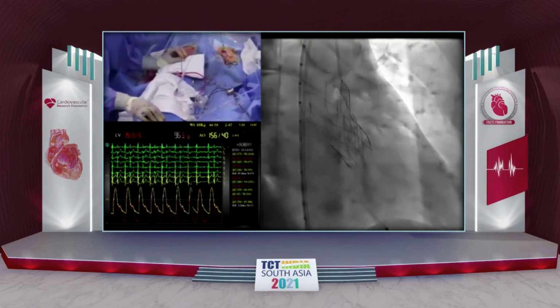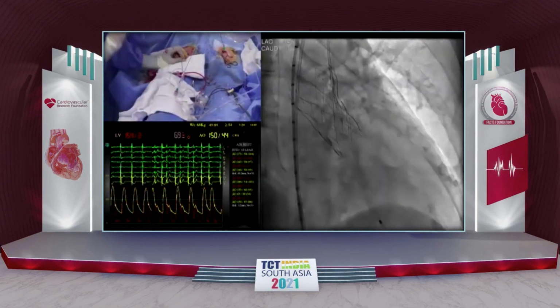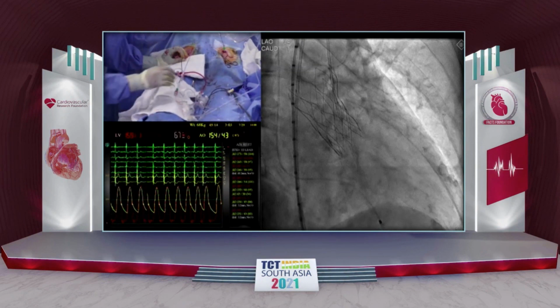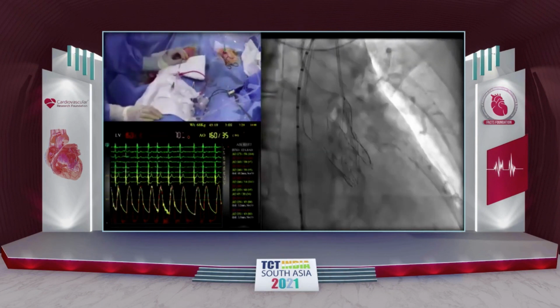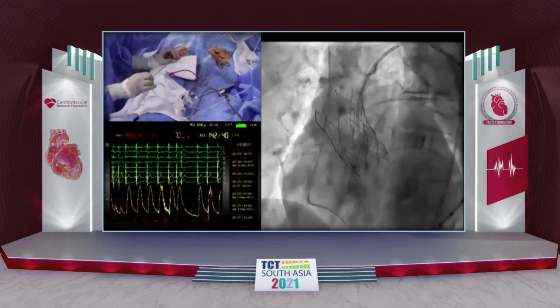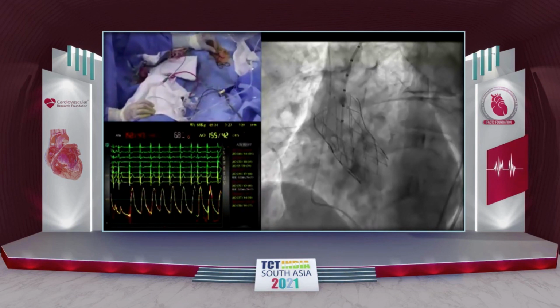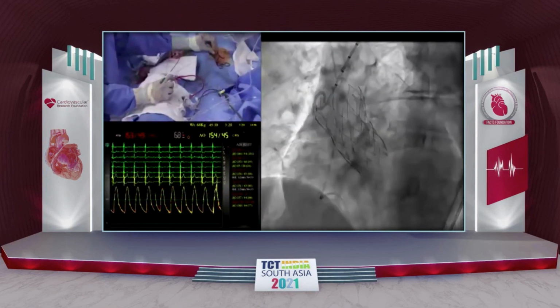And so see, you're right. Despite the significant calcification and ellipticity, you get the normal elliptical changes due to the anatomy, but the valve is very well expanded. One of the things I find interesting is my initial concern, when you have less frame, that the radial strength will be less. But they've engineered the nitinol and the strut thickness so that the radial strength is comparable to a CoreValve, but the cells are much larger. I think that's intriguing, and this is an example of that. It's cool engineering. The guys have done well. Okay, let's align the frame again.